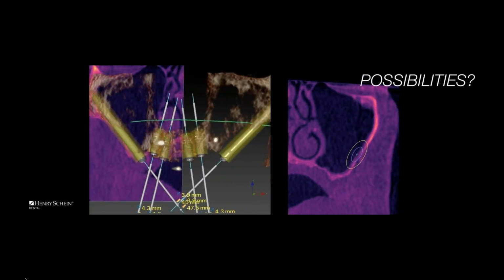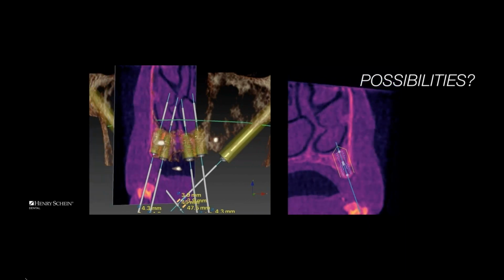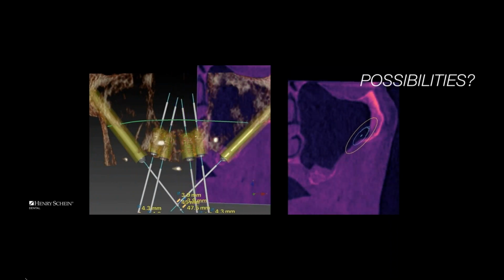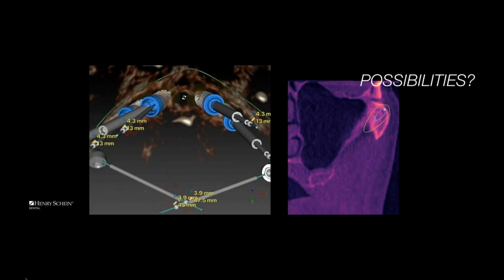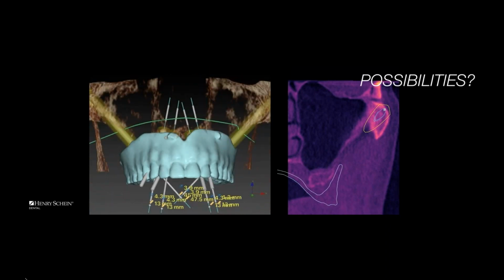This is very complex information and planning that we have today that is more than just taking a 3-dimensional radiograph and measuring 10 millimeters of length and 8 millimeters of width. This is using the data to the fullest, to being able to plan and then execute on that plan based off of a prosthetically driven design.